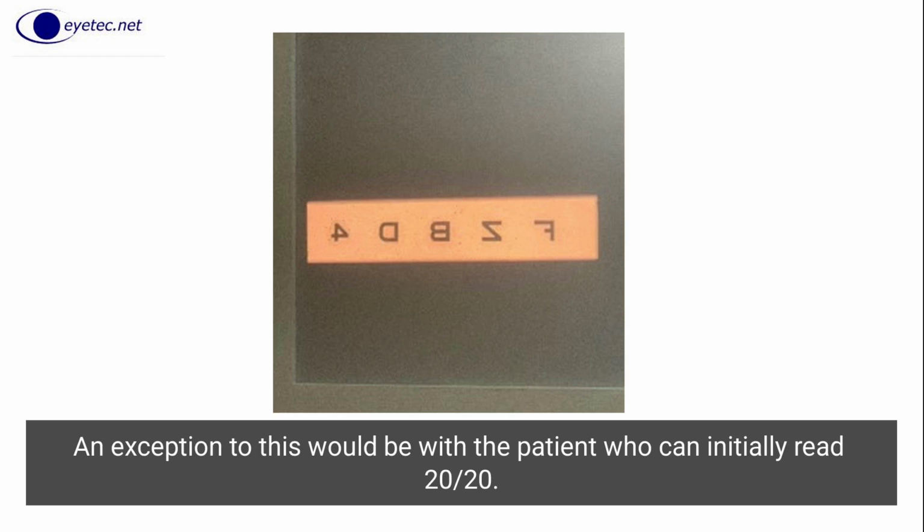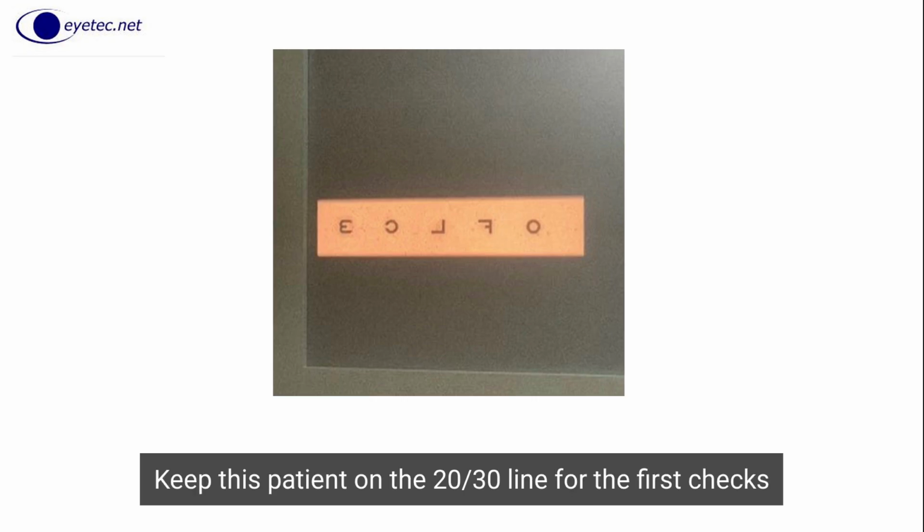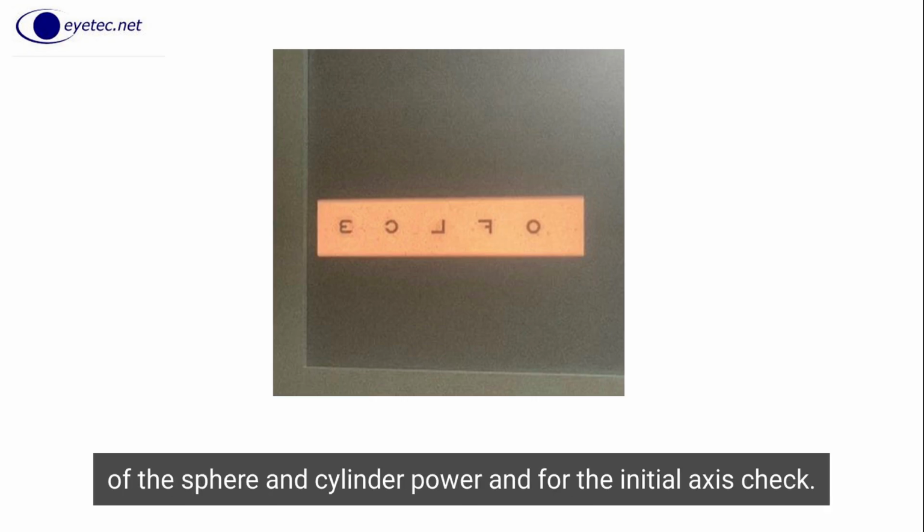An exception to this would be with the patient who can initially read 20/20. Keep this patient on the 20/30 line for the first checks of the sphere and cylinder power, and the initial axis check.